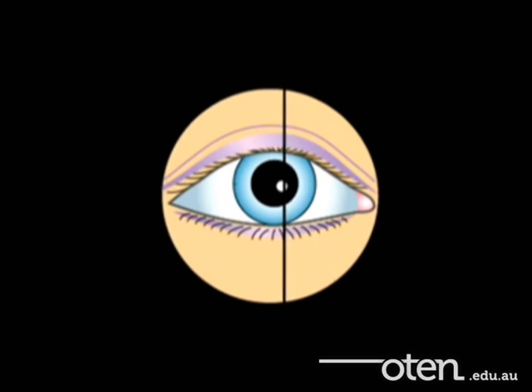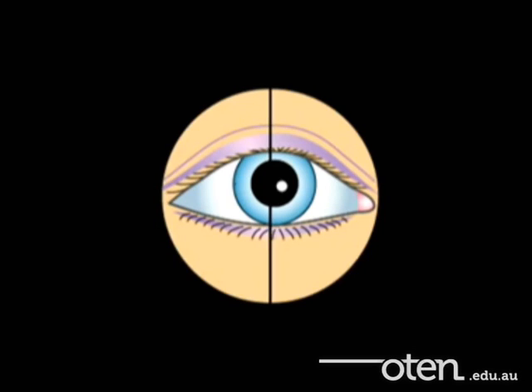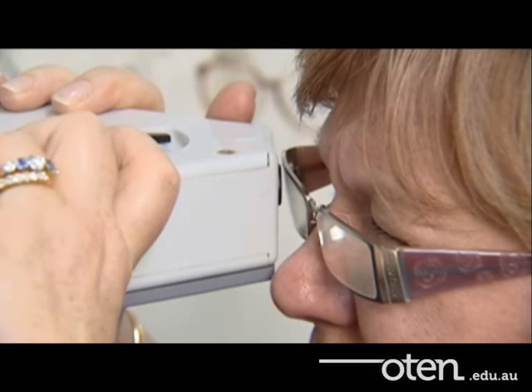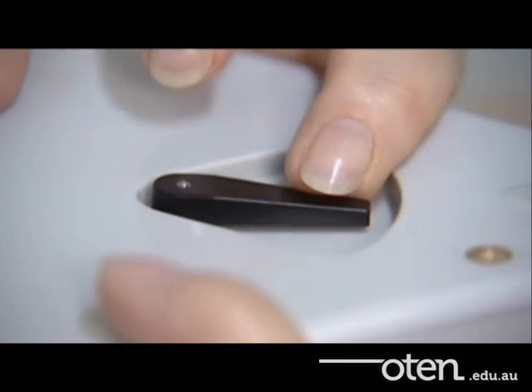The black line should pass through the very centre of the reflex on the client's cornea. The dispenser now flicks the occluda lever across to measure the other eye. Now I'm going to do the other eye.